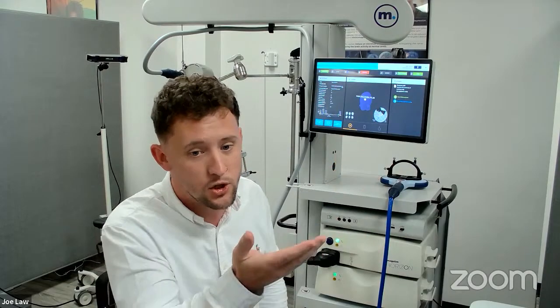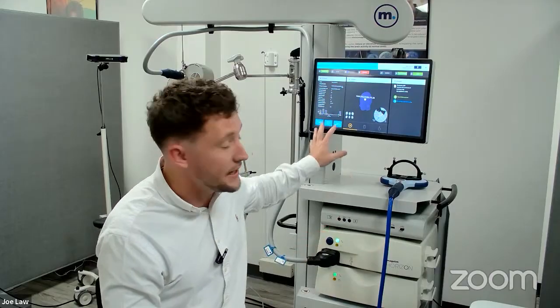What we've noticed is even when the thumb stops twitching visually, you can still pick up muscle response with the EMG. So you may not see a thumb movement, but the EMG will pick it up, which allows you to keep bringing that intensity further down. Great. Thank you so much, Joe, for that answer.